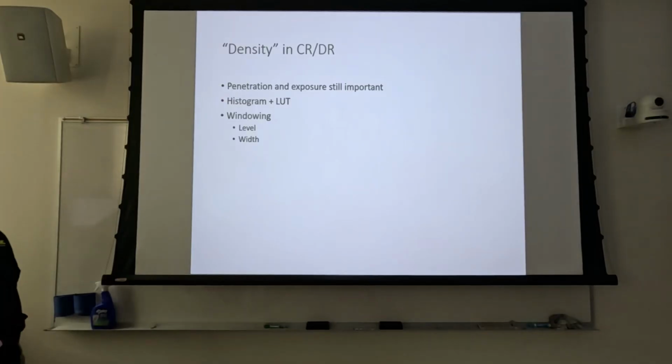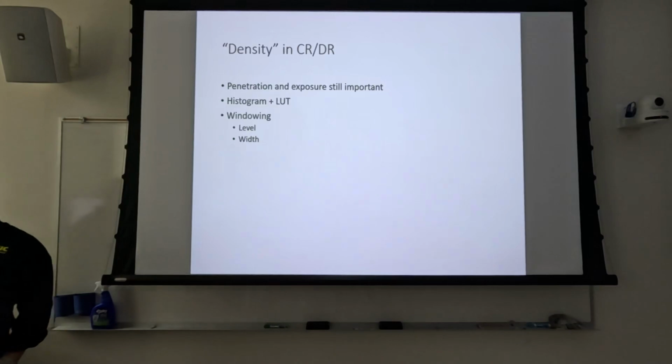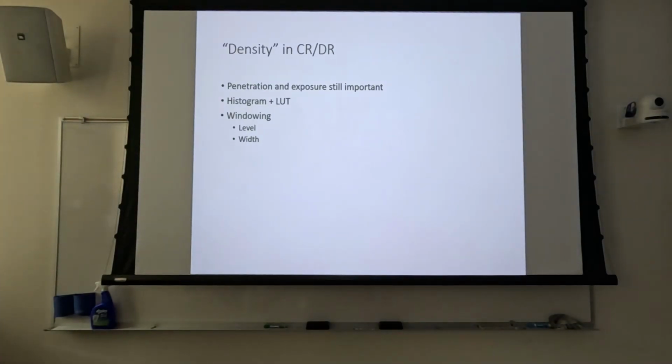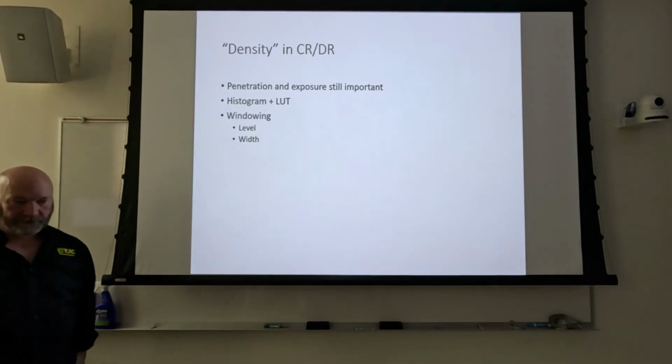on our index number. So remember, we've got 2 histograms working. The lookup table is a stored histogram inside of the computer. So it's the ideal image. And we didn't do it when we put this new machine in.